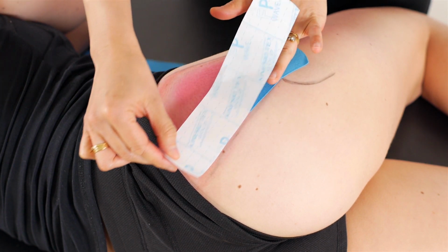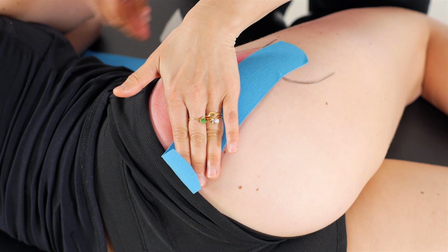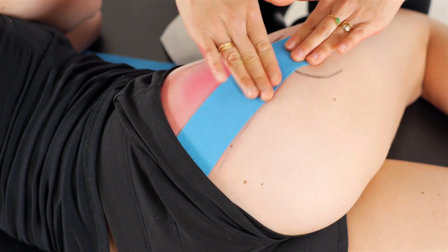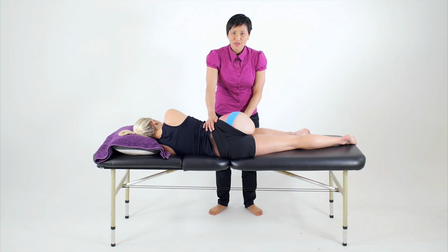From here, we roll the tape off the backing with 15 to 25% stretch. And once we get to the end there, let the tape settle before we roll it onto the skin. Rub the tape to activate the glue. And once we've completed our taping, make sure to reassess the muscle for changes in length, as well as any strength changes if that was in deficit. And of course, contextually, we want to reassess that client within the context of their functional limitation.